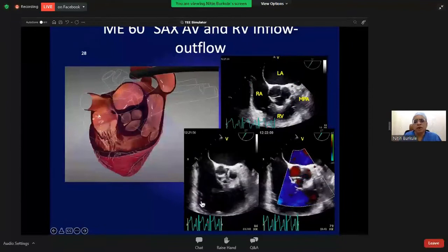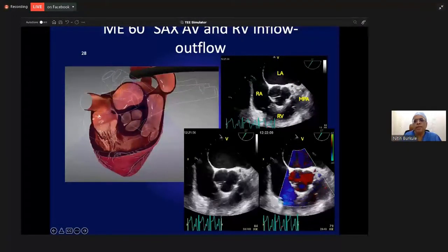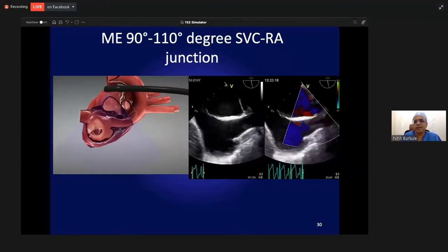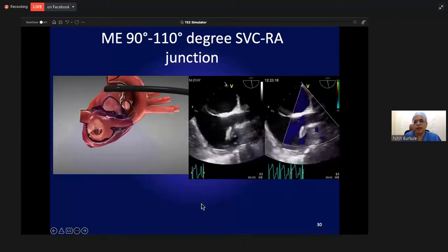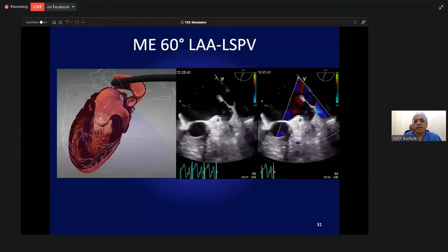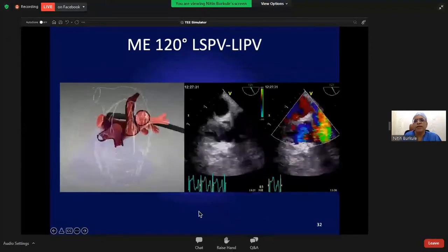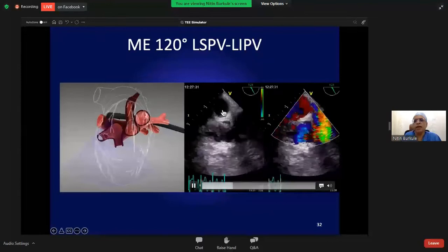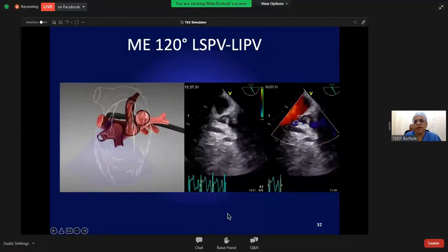This is the short axis view of the heart with the RV inflow and outflow. This is a 90 to 110 degree view with a rightward clockwise rotation, and you can see the superior vena cava and inferior vena cava entering the right atrium. This is the mid esophageal 60 degree view to look at the left atrial appendage. And this is an unusual view of 120 degrees, where you can see both the left superior and left inferior pulmonary veins entering the left atrium with the carina in between.